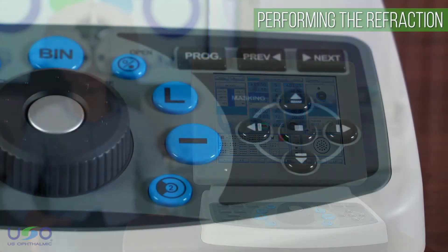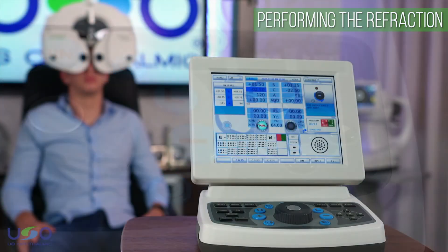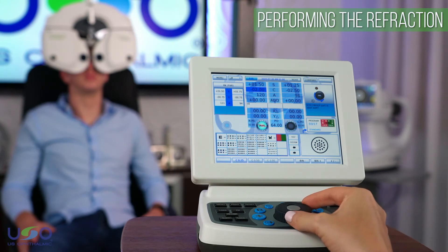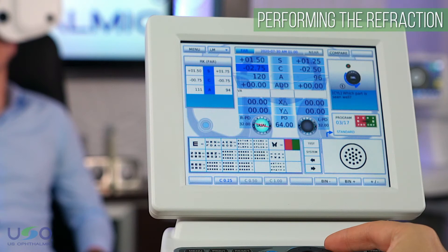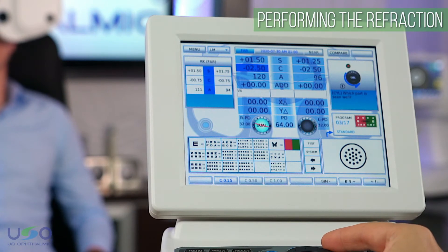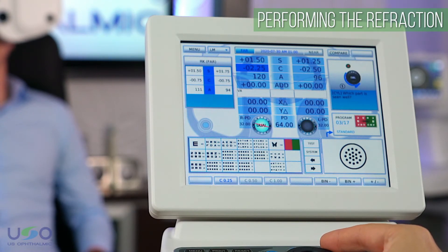To adjust the cylindrical power, you can begin by selecting the cylinder option on the screen. With the central knob, you can increase or decrease the power of the cylinder, similar to the procedure carried out for the spherical power. The values can be adjusted in accordance with the patient's feedback.